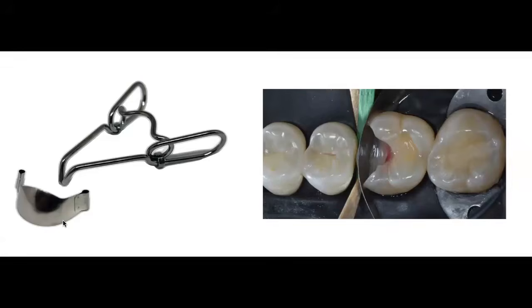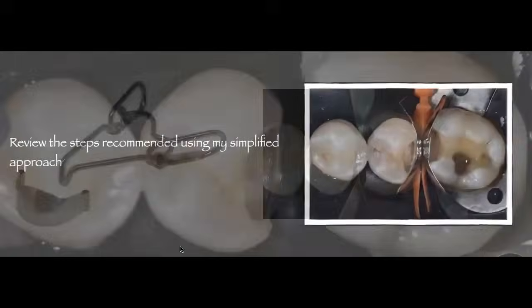And again, that has to do with the stiffness of the band. So this is a good clinical scenario where you can use a saddle matrix band in order to elevate the margin. But again, they're not made for every single case out there.